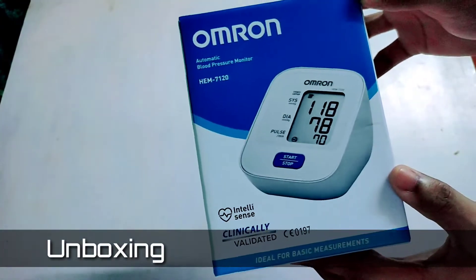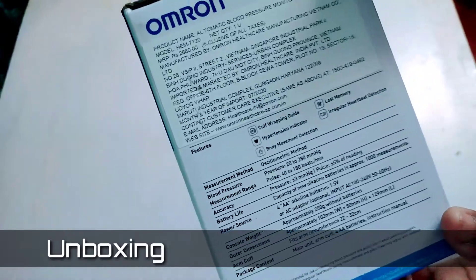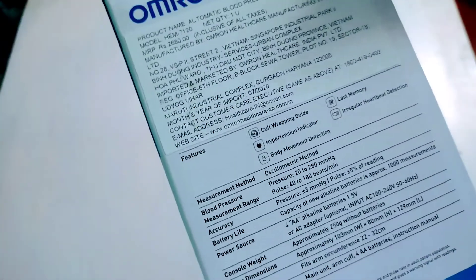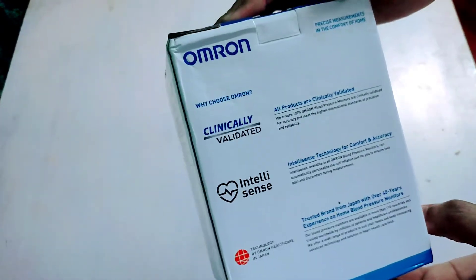It comes in a cardboard box with Omron's branding over it and all the tech specs and features mentioned at the back. We will discuss each one of them later in this video. The MRP written here is 2680 but I bought it for 4800 rupees from Amazon.